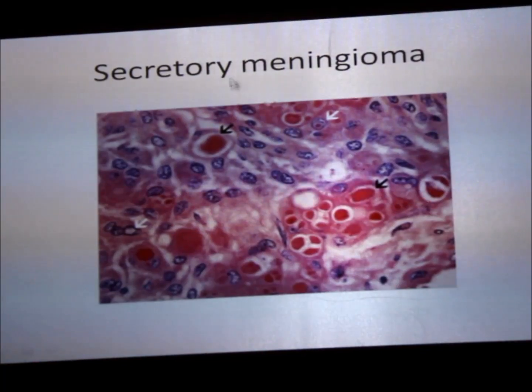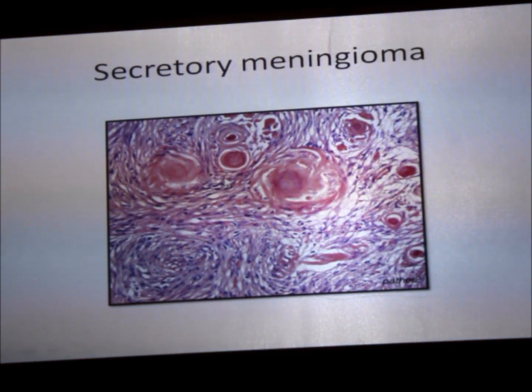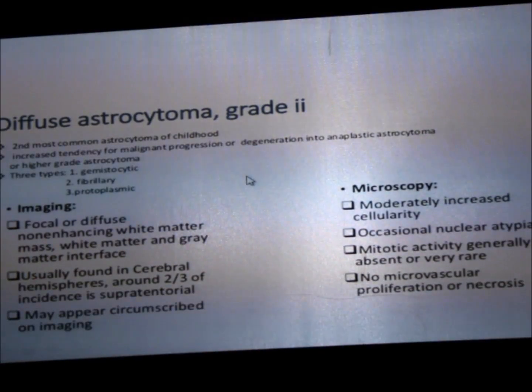So tumors arising from the meningothelial cells show secretions like this, pink secretions. They are known as pseudopsammoma bodies. We saw psammoma bodies in which tumor? Papillary carcinoma, thyroid. Okay, we saw psammoma bodies. They are concentric laminated calcified structures. So here also round pink secretions are seen in secretory meningioma. Pseudopsammoma body, meningothelial structures, the cells giving rise to the benign tumor called meningioma.